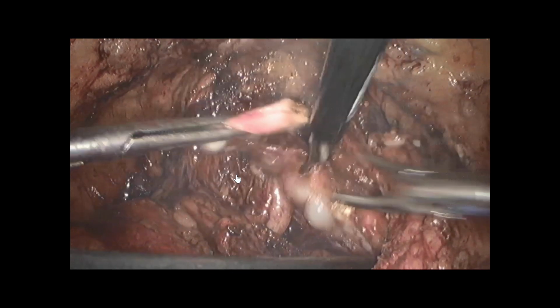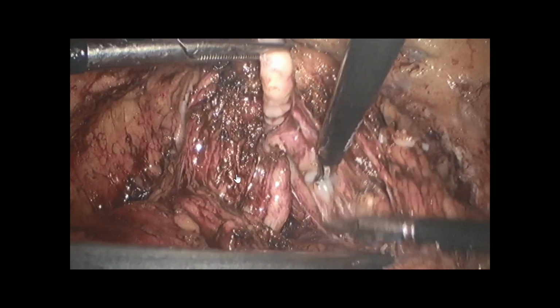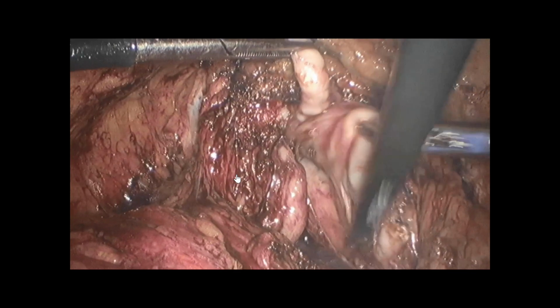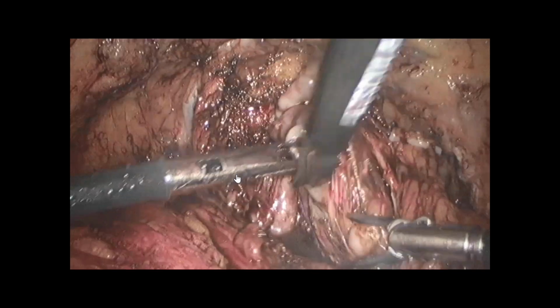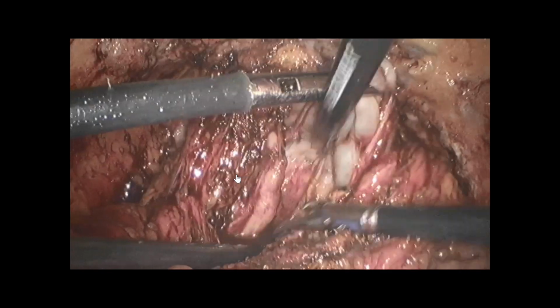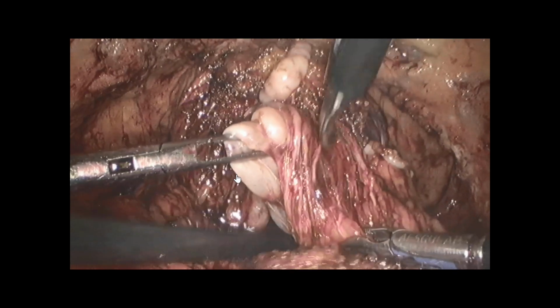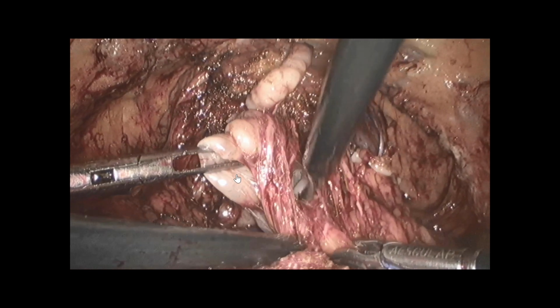It's really well codified. You see my assistant now will come and she will grab the seminal vesicle. So everything is codified. You must know perfectly what your assistant has to do. If I was doing it with the robot, it would be my fourth arm doing this. Okay? You see the grasper, and you see the image is totally fixed because the scope is fixed. So we just place in front of the scope what we want to do.